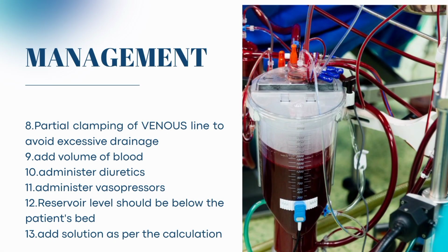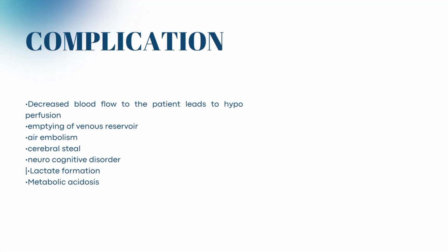Partially clamp the venous line to avoid excessive drainage. Add volume of blood in case there is a sudden emptying of the reservoir volume. Add diuretics in case of edema. Administer vasopressor. The reservoir level should be below the patient bed. Add solution as per the calculation.